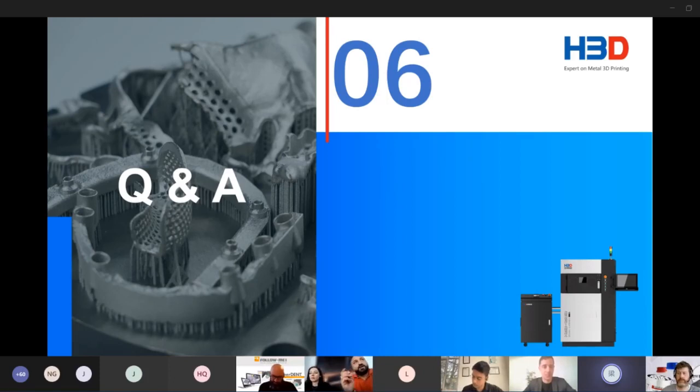But I faced a lot of problems in Turkey with the furnace. So I fixed the program at 980 for 15 minutes. And there is a cooling time. You don't take the platform out of the furnace at high temperature. You must let it cool, and you can take the platform out at 200 degrees to have a good result. That's my experience in Turkey.